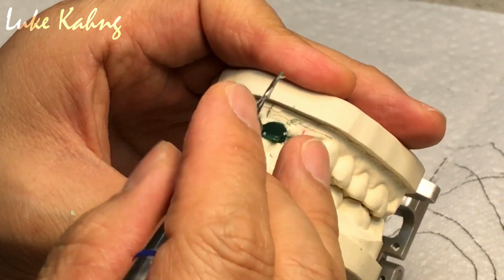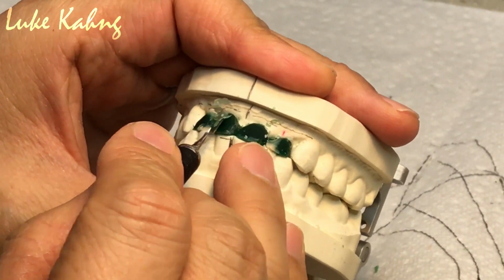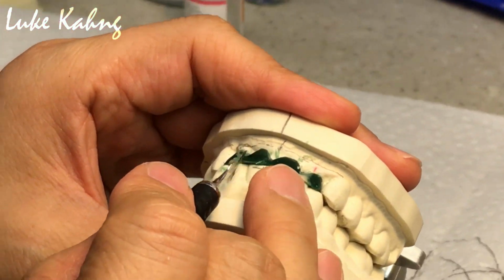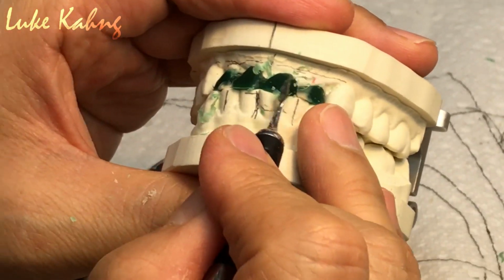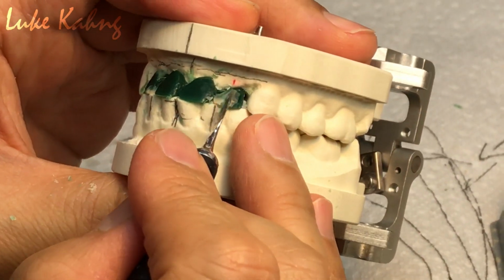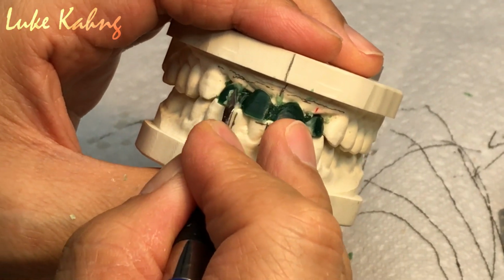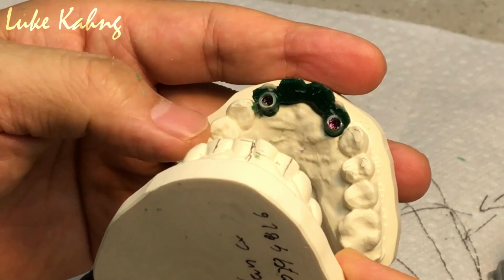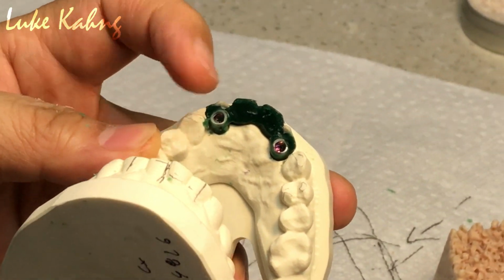And then I can make the same length and a great contour. Slightly overjet. Yeah. Slightly. Cannot make it perfect. But you can see a little bit more extended, this porcelain. Yeah. That's it. Okay? So this is a guide. We have to add a little.